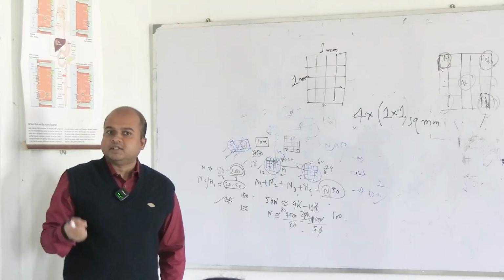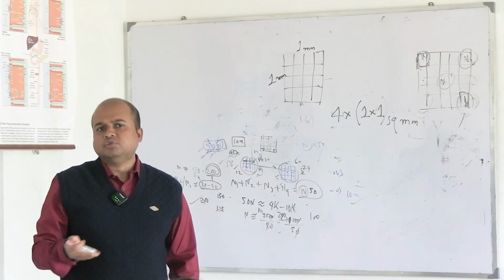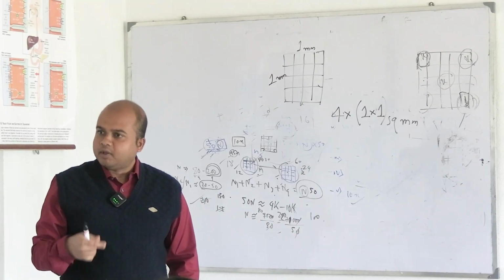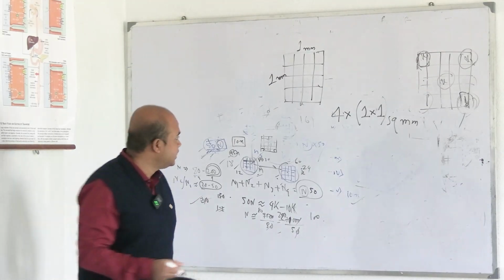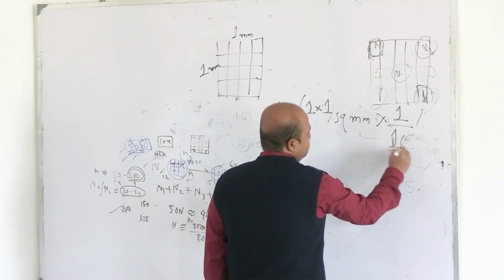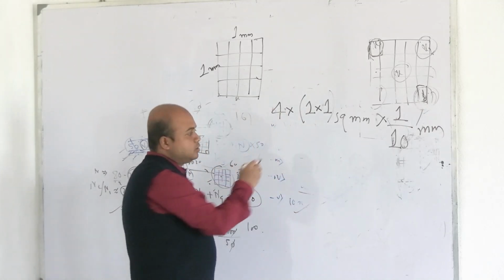and as blood is uniformly distributed after charging, very loosely we can say it's volume of the squares, but it is actually volume of the blood overlying the squares, that is into 1/10 millimeter for the 4 squares.